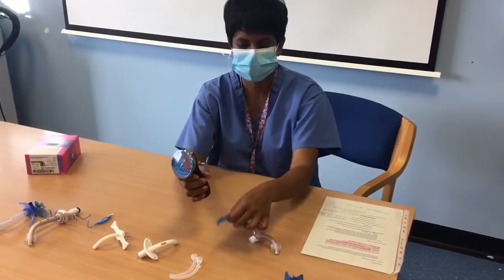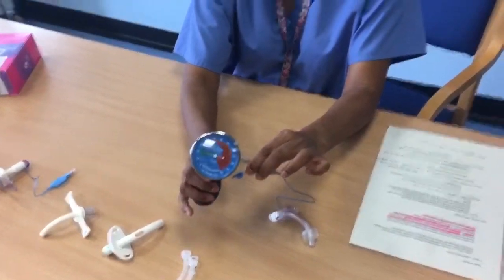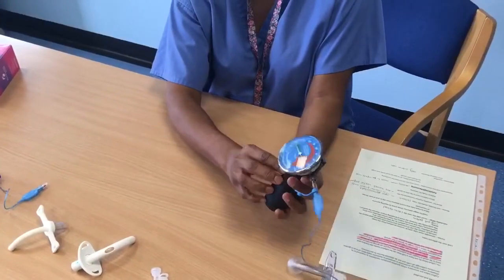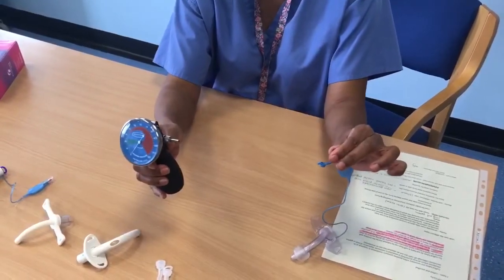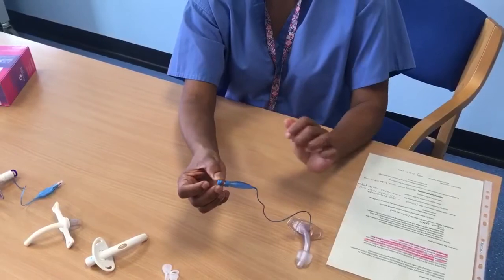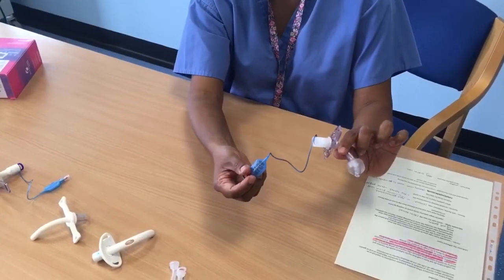Okay, so to do that, we just remove the cap and attach the manometer. Now I'm just going to turn it around to have a look. We want the needle to be in the green. It's just in the green there, so it is safe, and we can just take the manometer away. It's a one-way valve, so not to worry, and we can just replace that little cap there. So we know the correct pressure is within the tracheostomy tube.